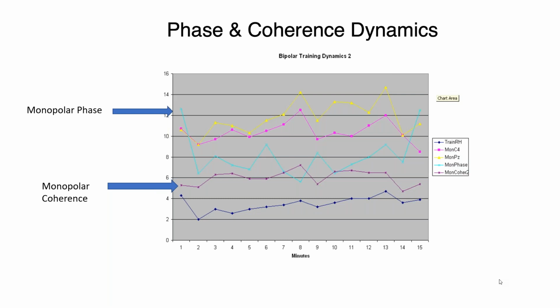And even now, when I sit with somebody and give them a verbal evaluation of the QEEG, if I'm going to even talk about bipolar conceptually, I almost have two different conversations with them, because like you say, you can't look at your screen to determine if this is working. You really can't. It is absolutely done with conversations with the people and the therapy that you're doing with the people, versus when we talk about the monopolar. Okay, so now we're going to work on focus. I'm going to put leads in the front, and we're going to repeat this again and again. And the conversation is so much different.